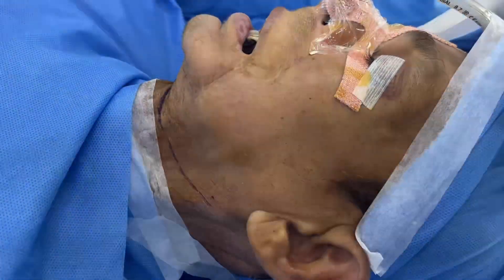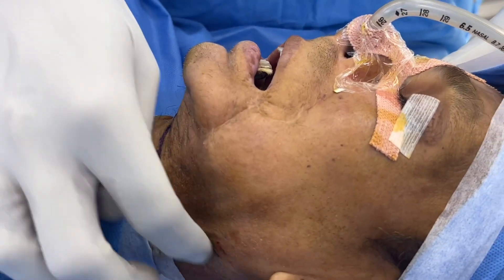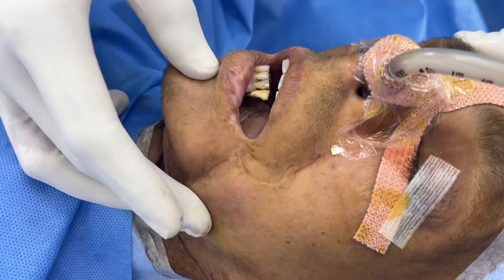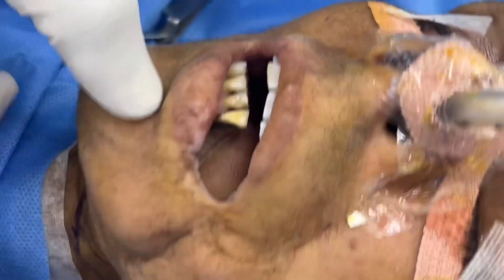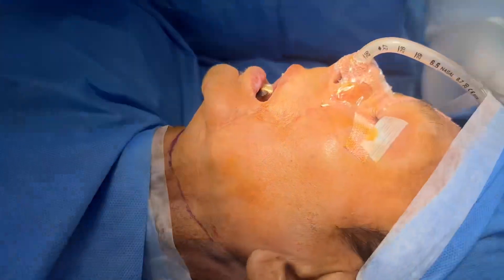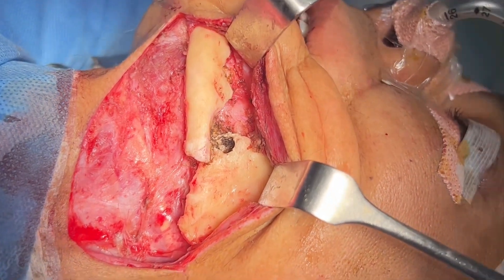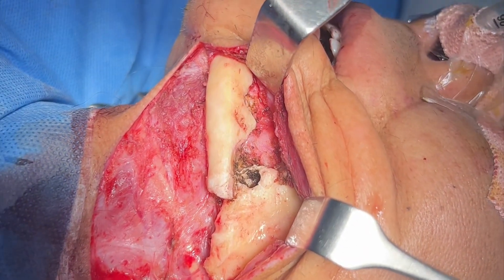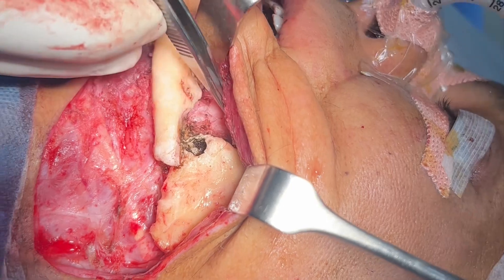We're going to do a surgery here — a post-oncological correction. He's got a pathological fracture, that's the plan. For the incision, he's got a depression here and tethering of his tongue with fibrosis inside. We're going to try and improve all of this with a few plastic surgery procedures, and we're also going to be doing bone grafting with correction of the pathological fracture. This patient sustained the fracture several years ago after oncologic resection and radiotherapy. You can see this is the place where it's mobile — there's a huge defect here.